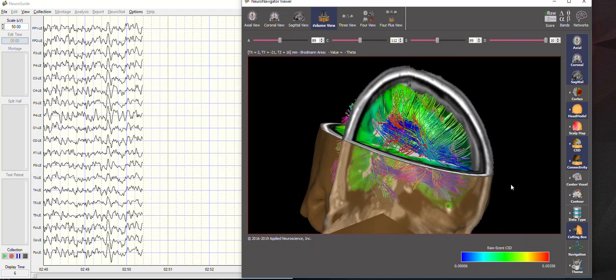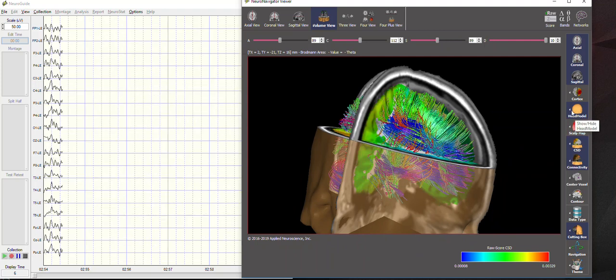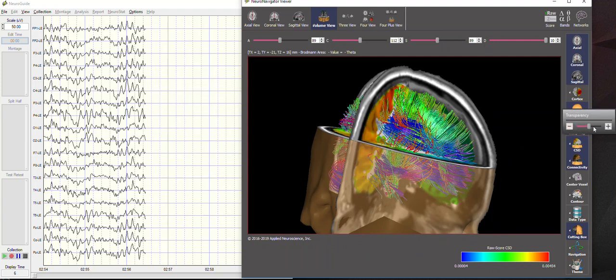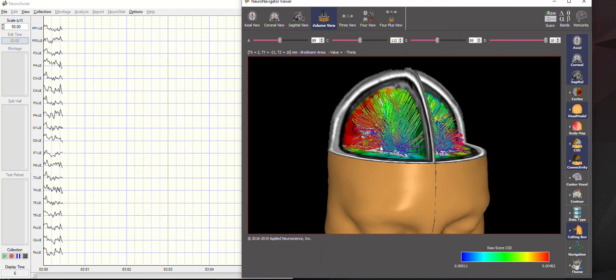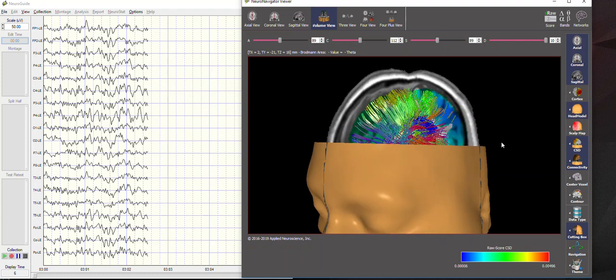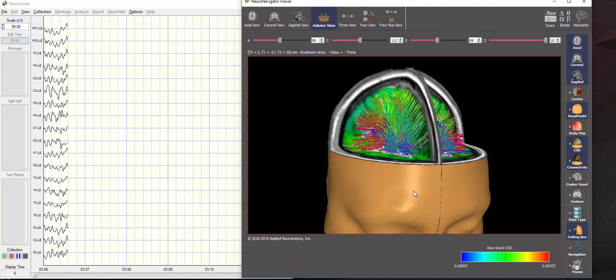So that is the new real-time release that is going to be available very soon.